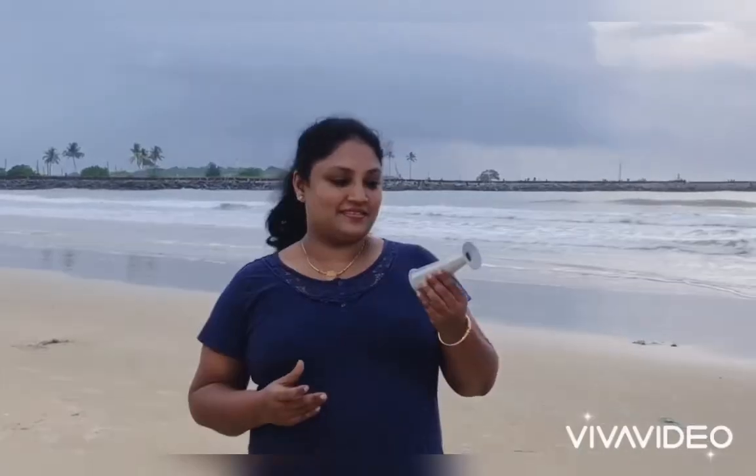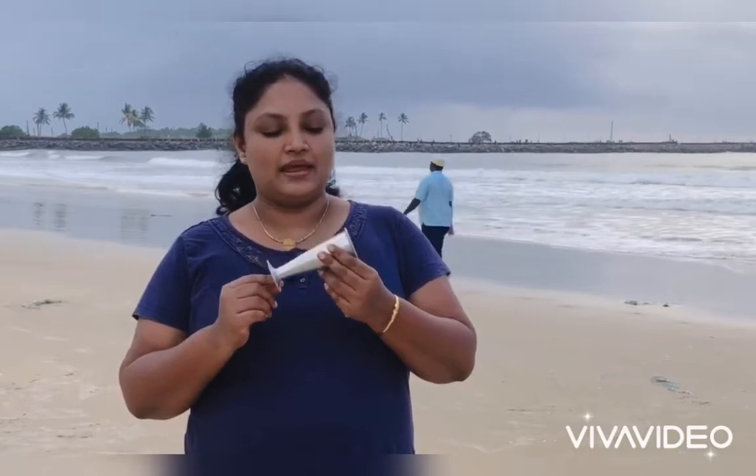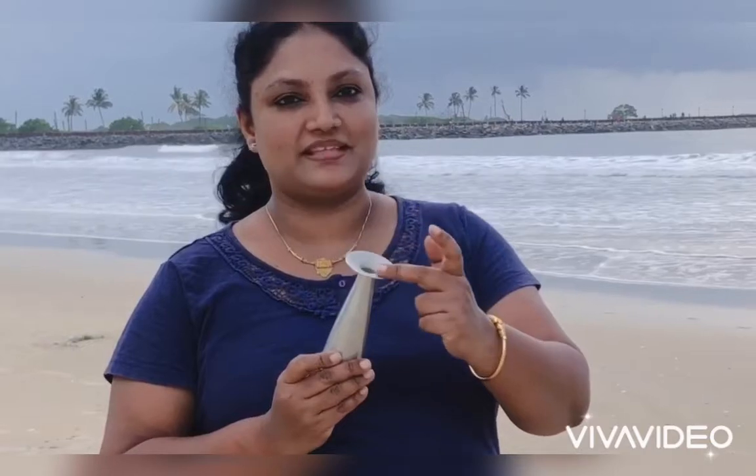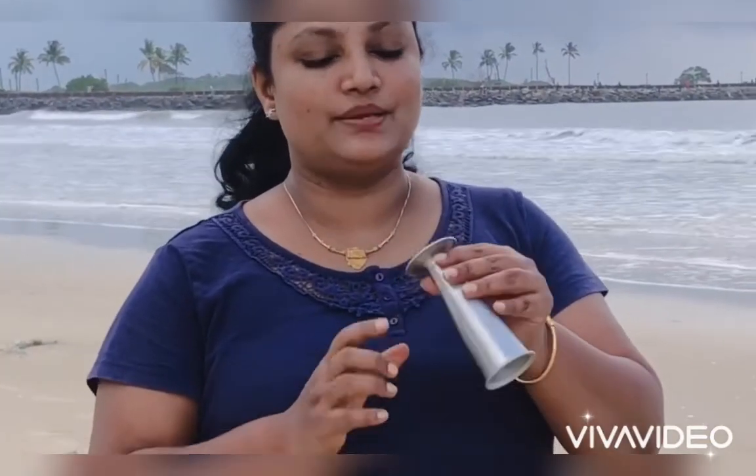It is also called a Pinard stethoscope. So we will be dealing with this instrument. It is designed to hear the fetal heart sound. It has got a broader or wide end and a narrow end. It is a hollow instrument. On the narrow end you can see a wide rim, which is also called the ear piece. You can place your ear over this to hear the fetal heart sound.